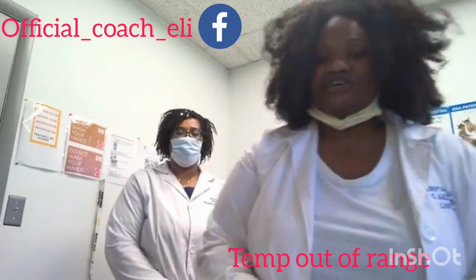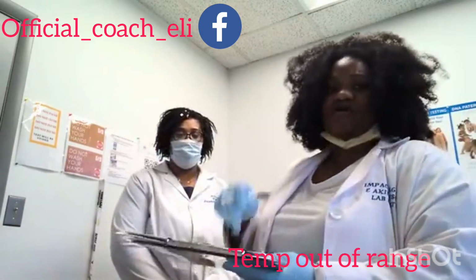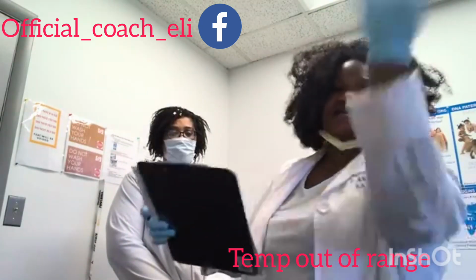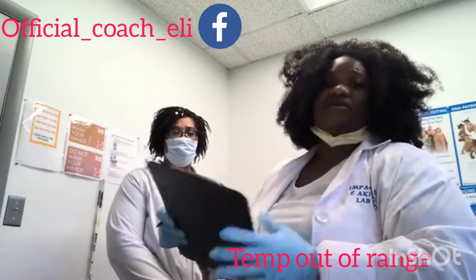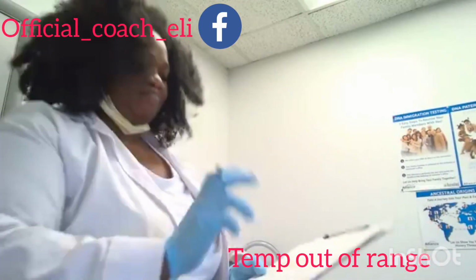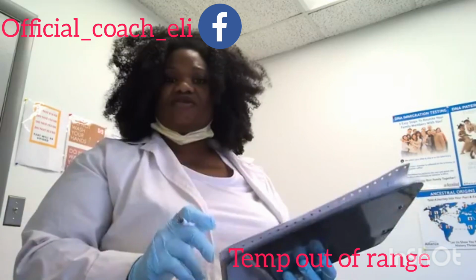And once she's done, then I'll go ahead and do step 4 of the lab copy. I'm gonna go ahead and do that. Put my name. The time should then be 2 p.m. All right, and I'm gonna go ahead and tell us where the bottle is going. In this case, it's gonna go to FedEx.